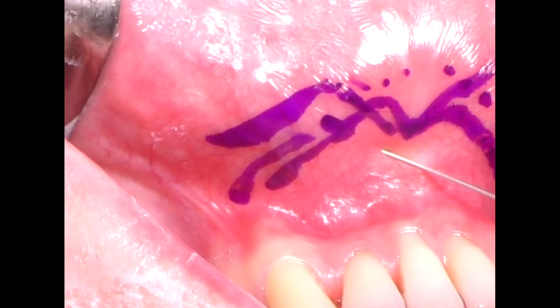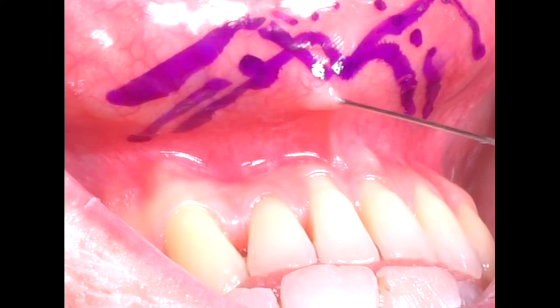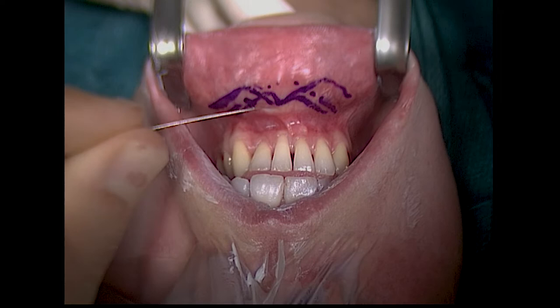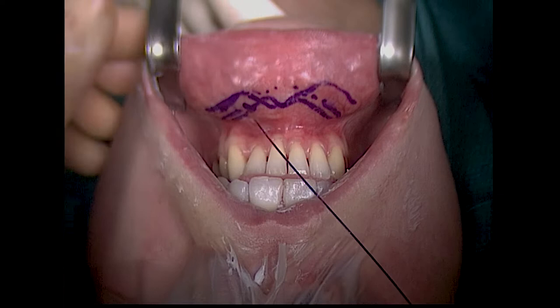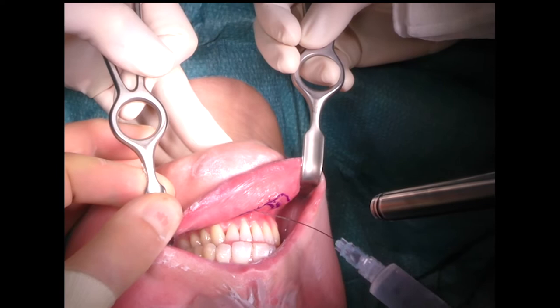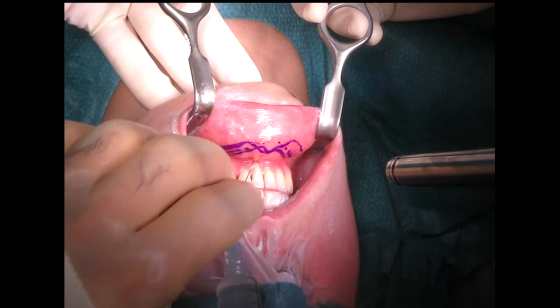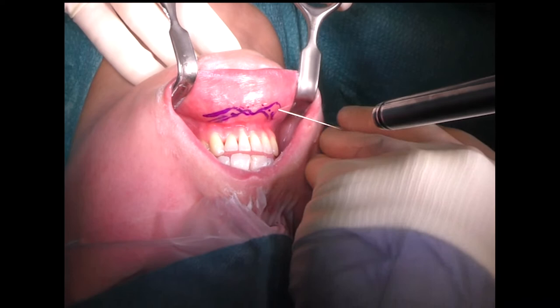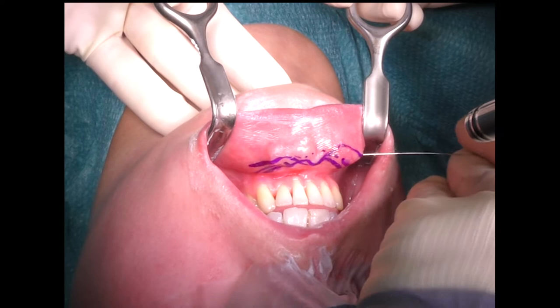We provided the local anesthetic with a disposable syringe on which is mounted a spinal needle — a Whitaker spinal needle — which has a bullet-shaped tip. For that reason, it cannot cause any ecchymosis; it cannot cut through arteries or veins. You can see that I deliver depots very close to the mandibular border, infiltrating the tunnel that we will make in a subperiosteal fashion, and also just below the incision line. A little bit of a superwet technique here: 50% lidocaine with adrenaline, 2%, and 50% saline.